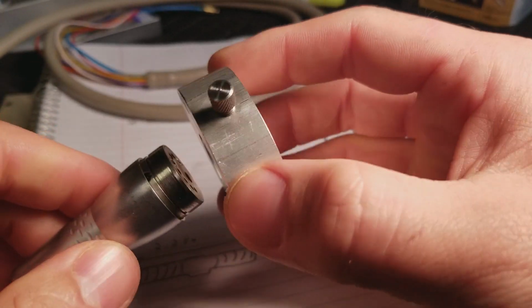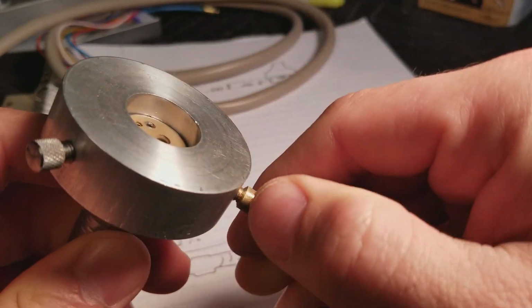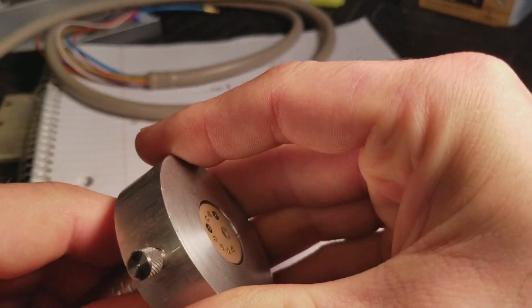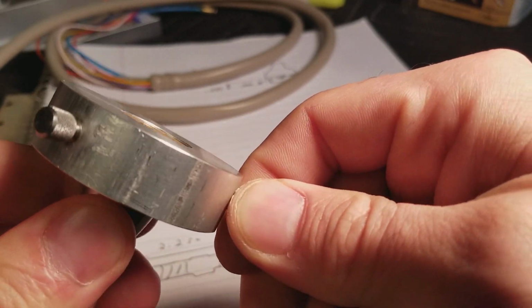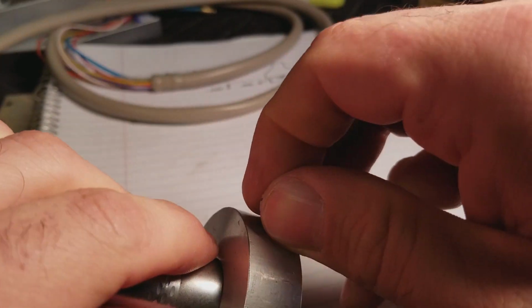Take that one off a little bit. This then just fits down inside like so. Just like that. Then you tighten this in and just make sure this thing fits right about, corresponds in place with these.